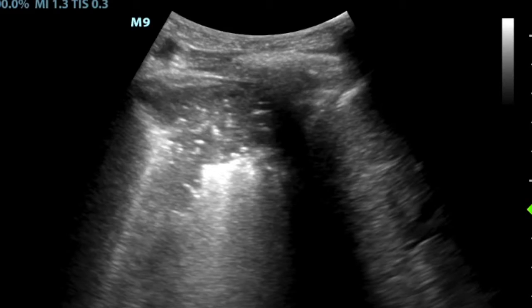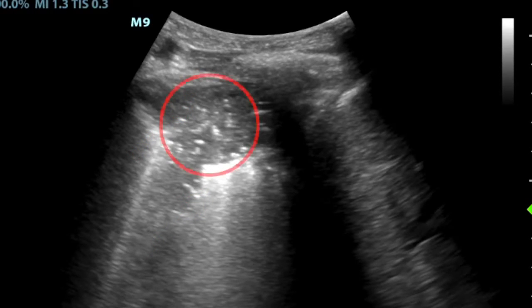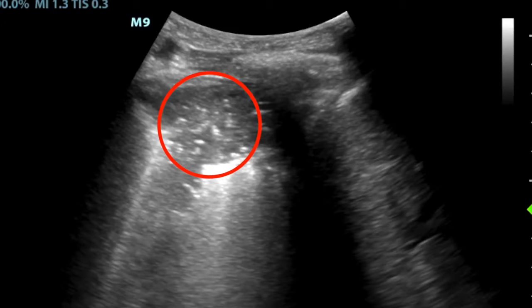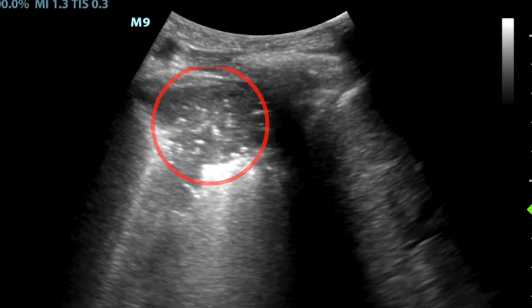In this still image, we can see the B lines here and the pleural interface is here. There's air in the lung beyond the B lines, but all the stuff in between here and the pleura that looks like a solid organ or stars in the sky is possibly consolidated lung or lung parenchyma that has collapsed, i.e. atelectasis.